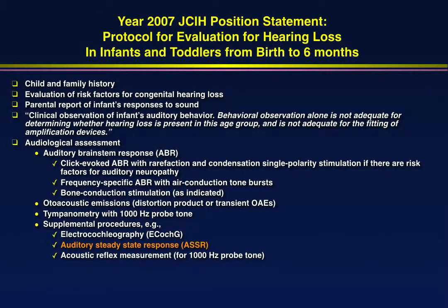Well, is ASSR required in infants? According to the Joint Committee on Infant Hearing, the JCIH, it is not required. The ASSR is a supplementary procedure, and I would agree with that. It's not needed in every child. Like electrocochleography, it's used selectively, but when it's needed, it provides very valuable information.